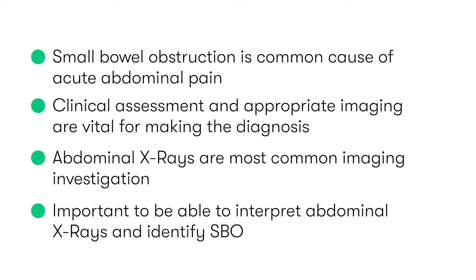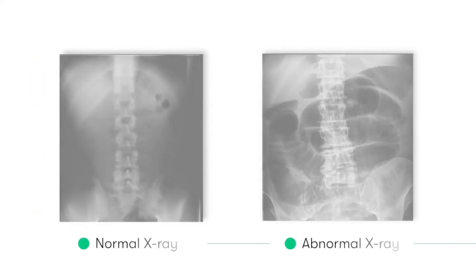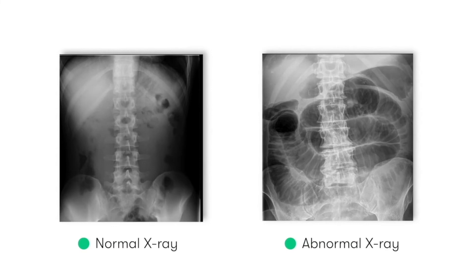At the end of this video tutorial, that's exactly what you'll be able to do. Here, you can see a normal x-ray on the left hand side and an abnormal x-ray showing small bowel dilatation on the right hand side. We should be able to instantly appreciate that there's a significant difference between the two images.